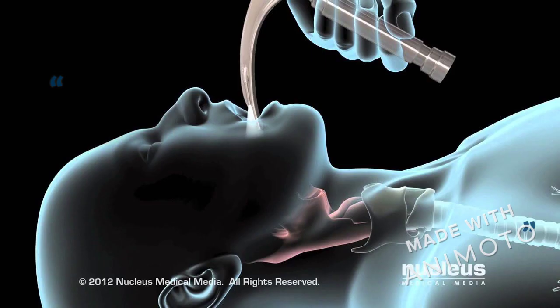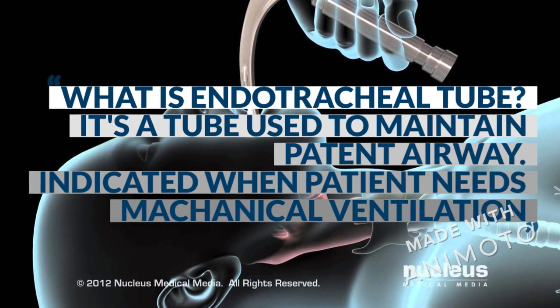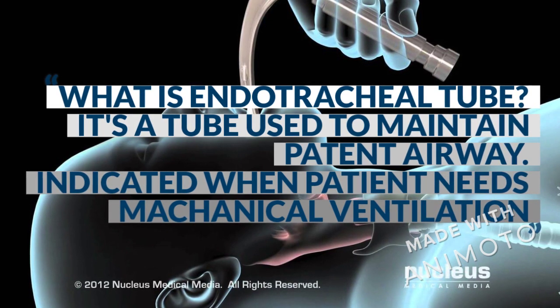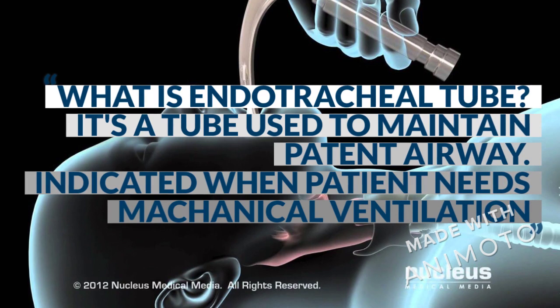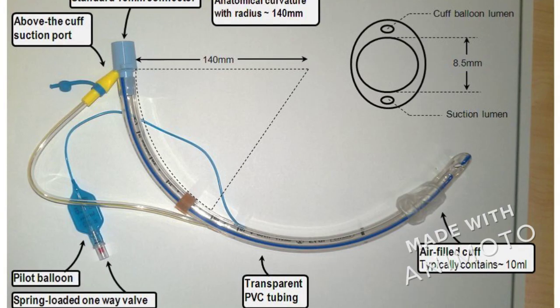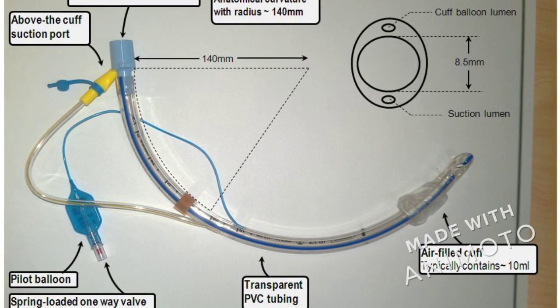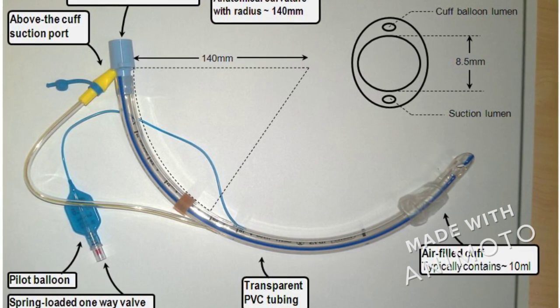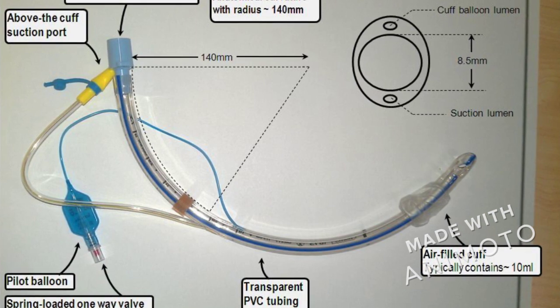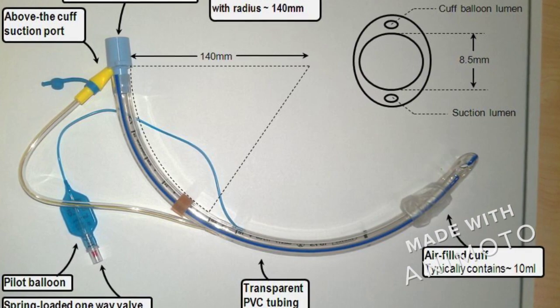So let's just begin. So first question which comes in everybody's mind is what is an endotracheal tube? It is a tube that is used to maintain a patent airway, and for the patients that need mechanical ventilation it is used. The next is what are the parts of an endotracheal tube? So it has a transparent PVC tubing, a standard 15 connector that connects it to the oxygen port or the ventilator ports. The next is the pilot balloon and an air-filled cuff.